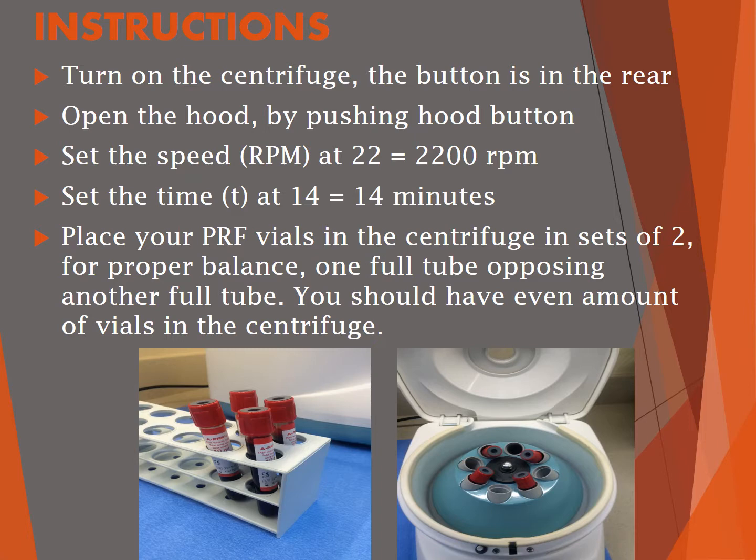Turn on the centrifuge — the button is at the rear. Open the hood by pushing the hood button. Set the speed at 22, which stands for 2200 RPM, and set the time at 14 for 14 minutes. Place your PRF vials in the centrifuge in sets of two that oppose each other for proper balance.